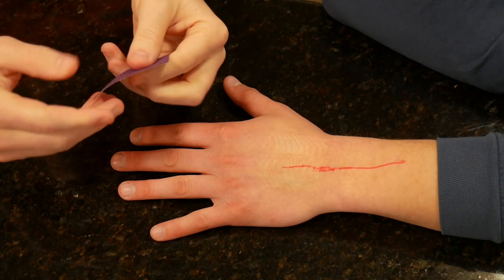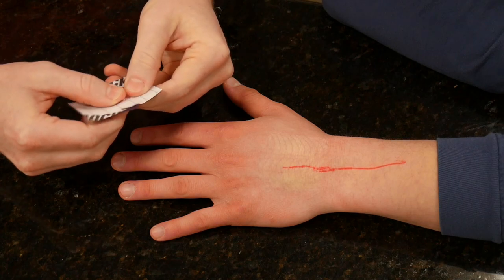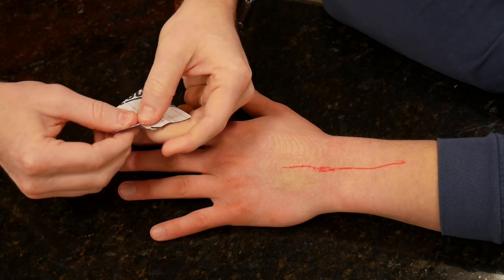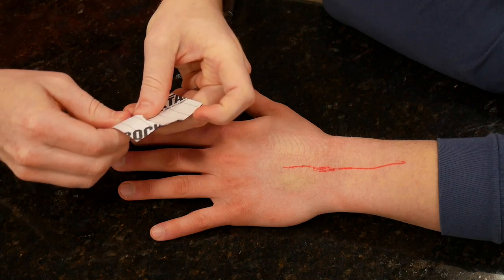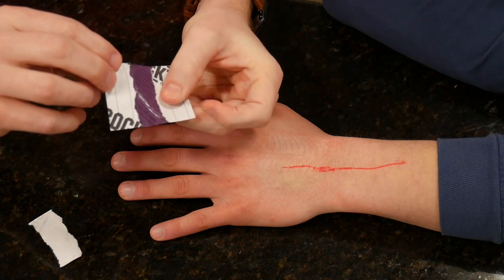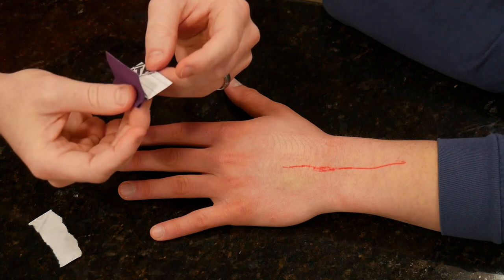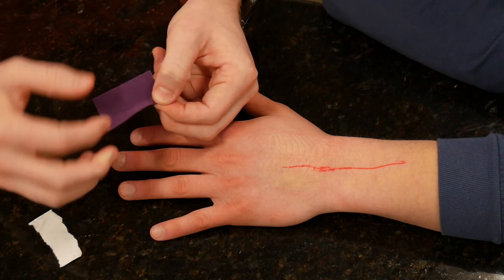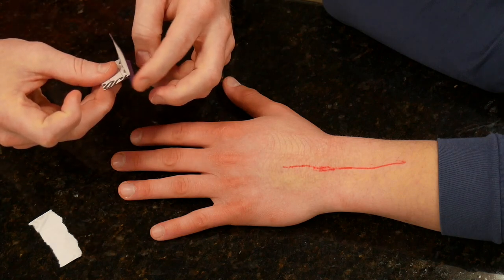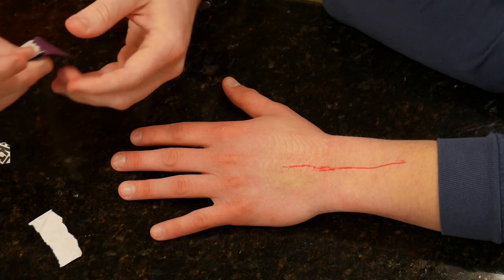All right, so we're going to take our piece of tape, and with this one, it really doesn't matter how you do it, but we found it's easier just to tear a middle portion out. Your end result is going to look something like this, and you can even do it a little bit wider than that. It's fine too. What you want to do is fold that on top of each other so that your tape is sticking together on itself. So it looks like you've got two little flaps here with the tape stuck together here. So we'll go ahead and tear the rest of that off on both sides.